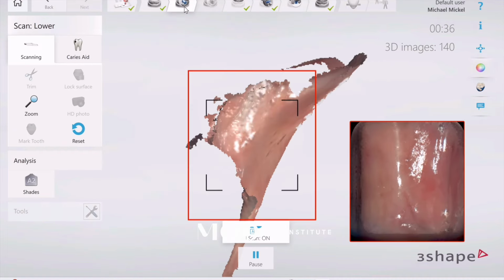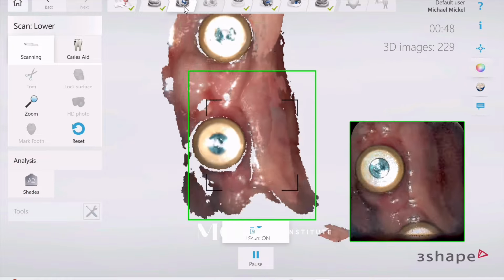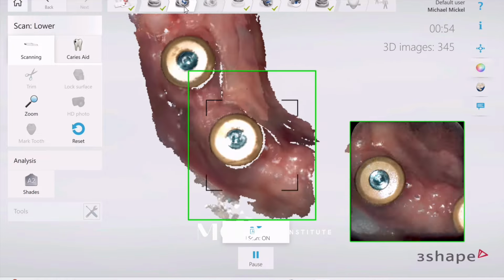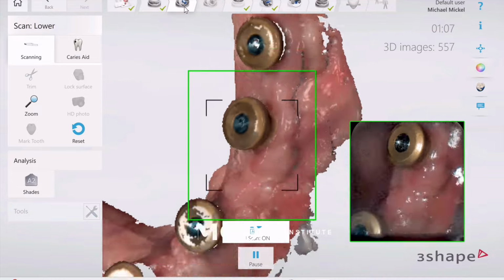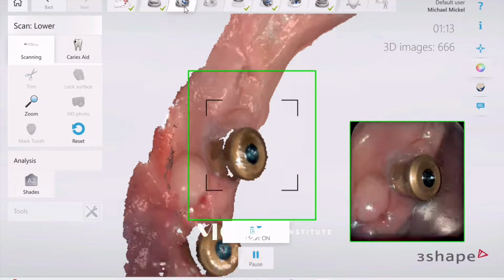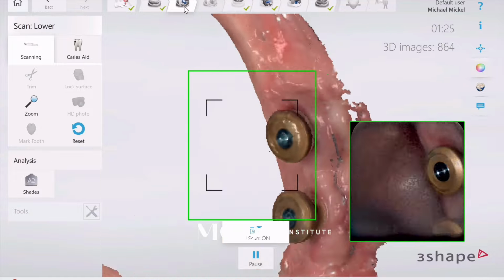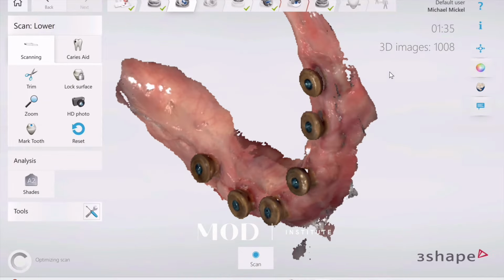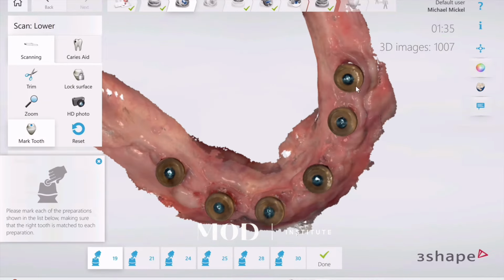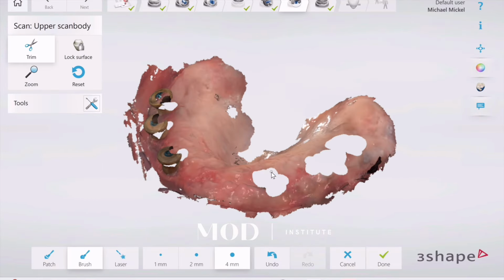And then you mark the locations of the implants, and we're going to go in the lower arch and start scanning on the attached tissue somewhere. It could be a marker that you place pre-surgically, and then proceed on with the arch. And here we're, again, making sure that those scan caps are connected. Now, it's not really important that this scan be super accurate. We're not actually using these for implant locations. They're just a soft tissue scan, and it's just a reference to align the scan body scan to the soft tissue scan. I'll show you how we do that.